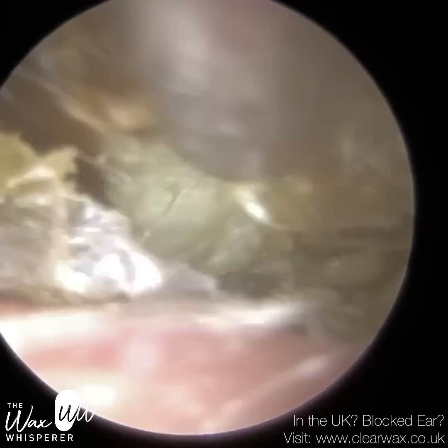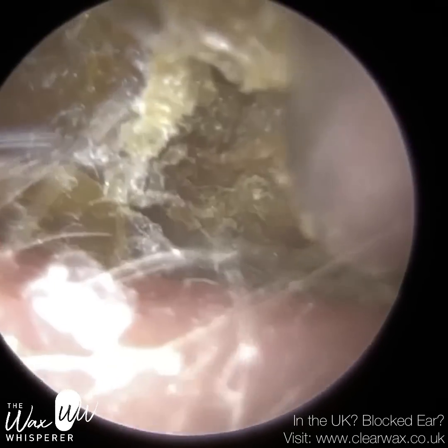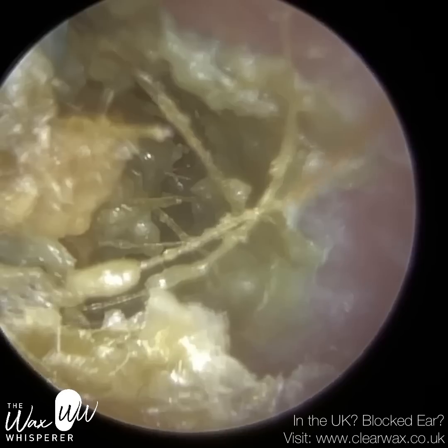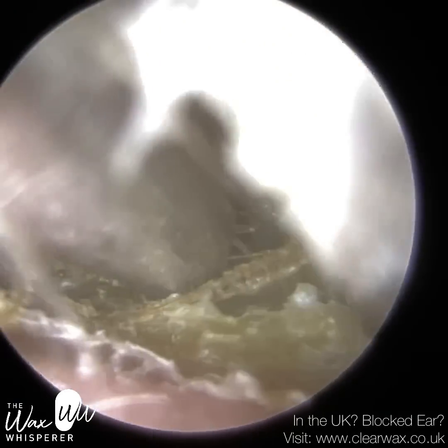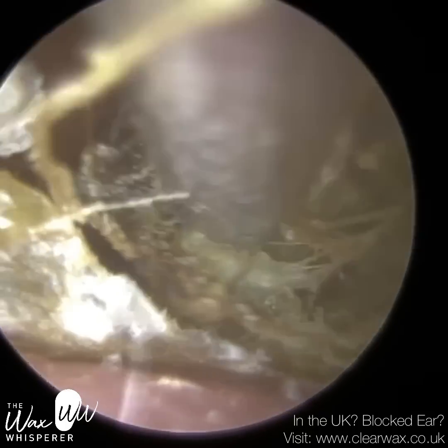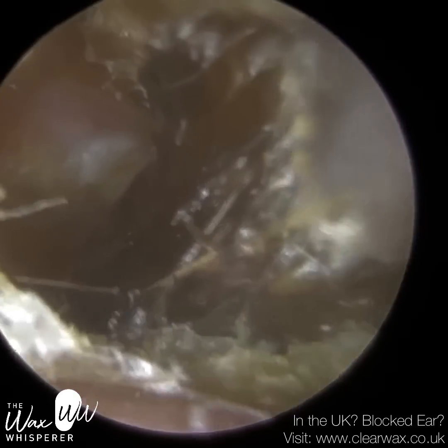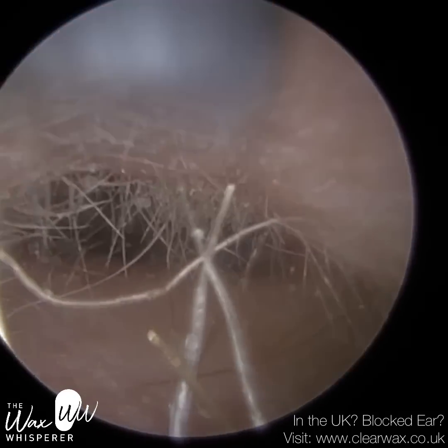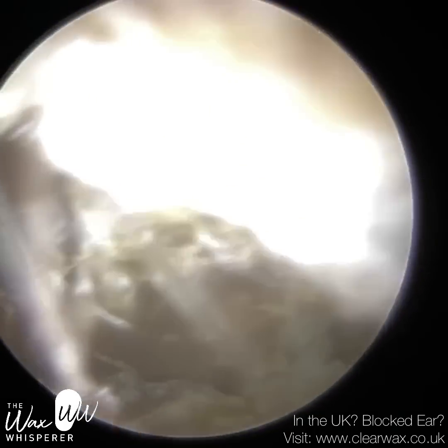I'm going to revert to an ear hook and try to get over this plug of dry, crusted wax and skin. Because of the ear anatomy and the slight inflammation, it's a bit tricky. The entrance is quite narrow, so to insert the hook and get over it — you can see there's a bit of an opening there — I managed to insert the hook and then slowly glide over the plug without making contact with the canal walls.